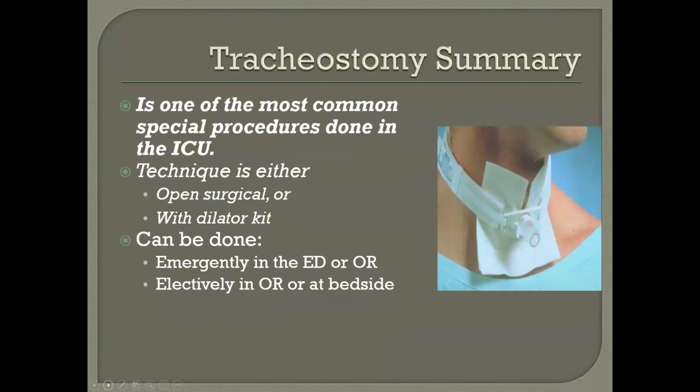So let's look at tracheostomy here. At our hospital, we actually assist with intubated patients. We assist in transitioning patients over to a trach tube. These are patients that have been intubated typically more than 10 to 14 days. There are exceptions. If we think the patient's been doing better, they're day 15, but they've been weaning a lot better on pressure support, we might give them a few extra days on that. But typically around 14 days.